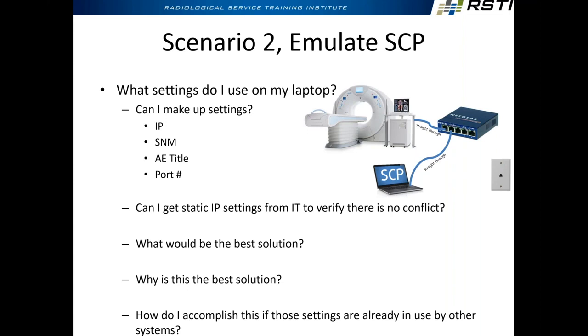You could go into the CT and do that, but that's a pain in the butt, and you may not have access or passwords to get into it. But the beauty of using the PACS settings is it's already configured. Just plug and play. Everything's already configured, it works. So you plug your switch in there and you set up your laptop with the PACS IP address, the PACS port number, and the PACS AE title.